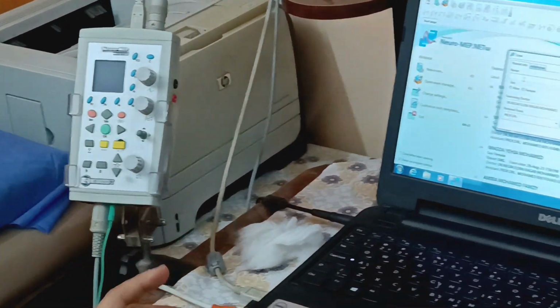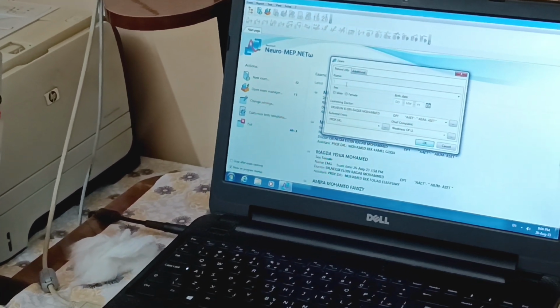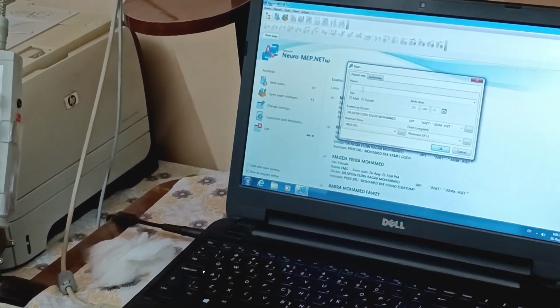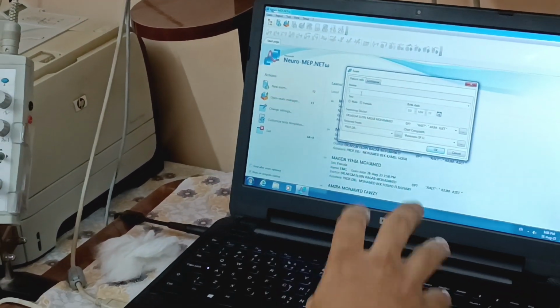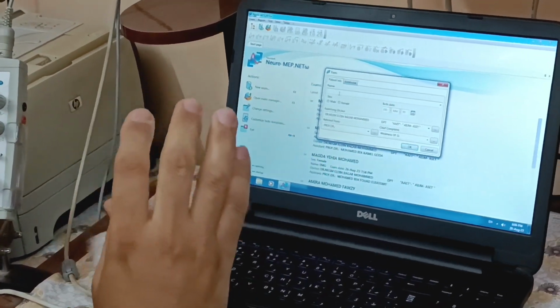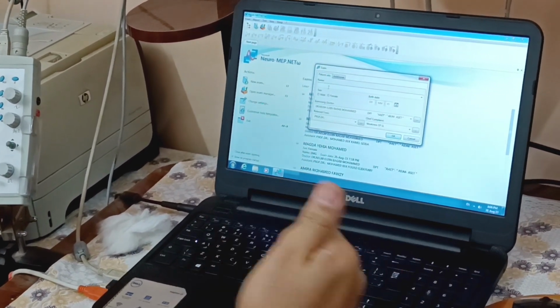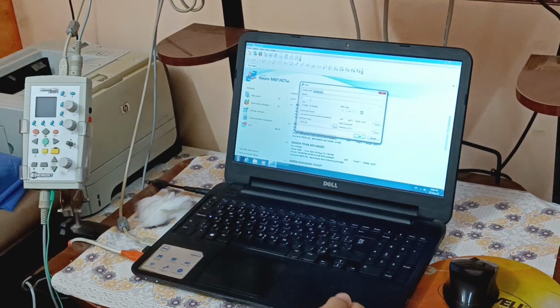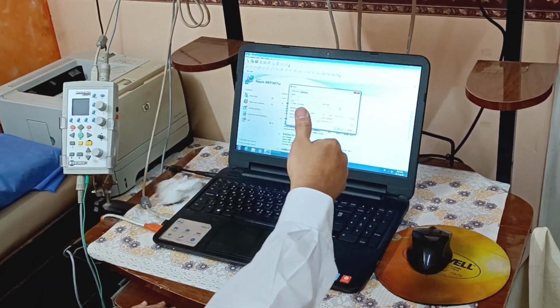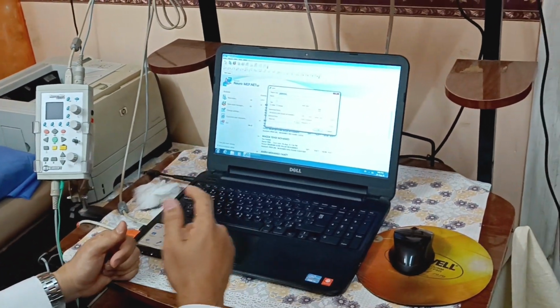The second part, we will talk briefly about the motor nerve conduction study. So I will say motor nerve conduction study: I will hit or strike the nerve. For example, the median nerve, the ulnar nerve, radial nerve, musculocutaneous nerve, axillary nerve, spinal accessory nerve, any nerve I want. So I will hit this nerve and get the waveform or the action potential from the muscle itself.